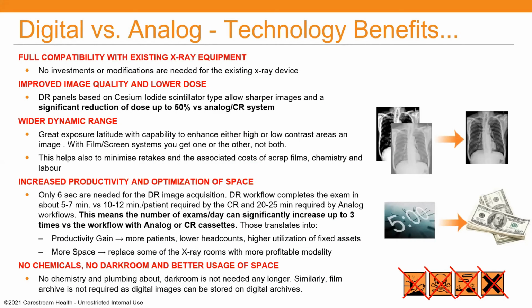But easily, this was well remarked by Dr. Kumar and Dr. Pankaj before. So you see there are many sites where the technology is very attractive compared to the analog side. Just to mention one here, I put full compatibility with existing X-ray equipment. You don't have to touch the analog X-ray equipment you have.